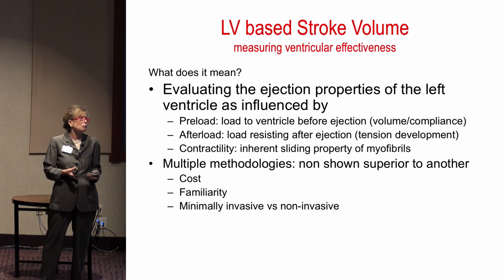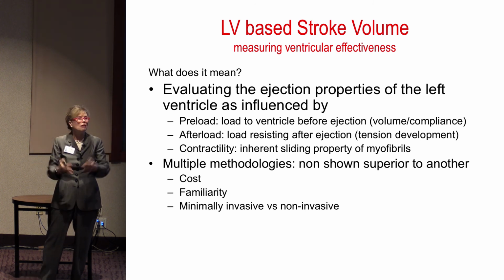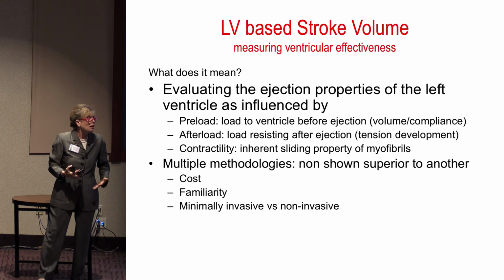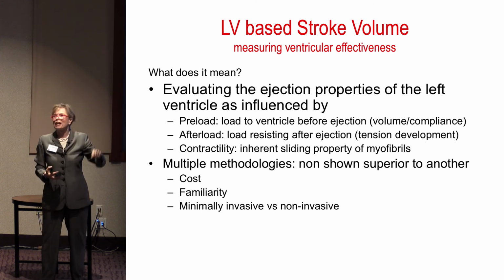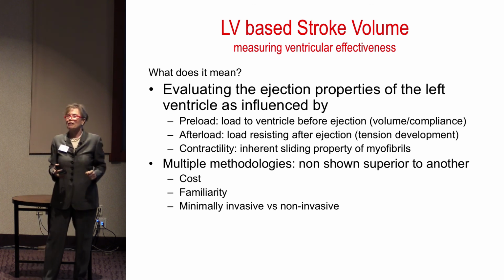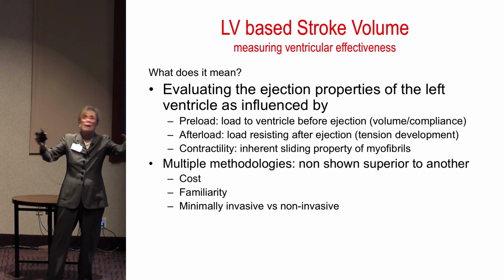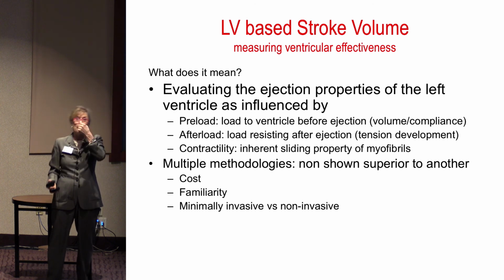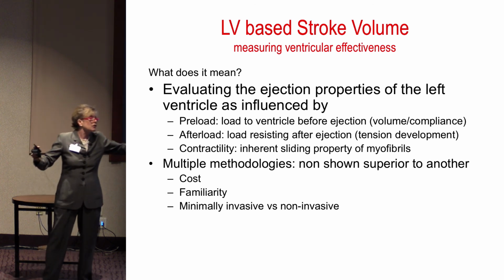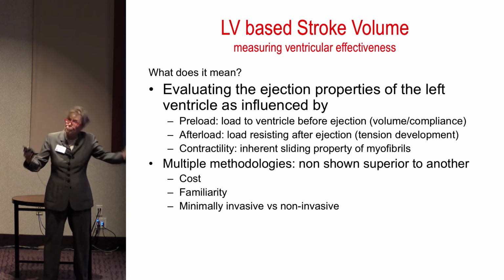So one thing I like to remind everyone, we have a great audience, a lot of variety in terms of profession, but really important for everyone to remember. If you can't get a pulse ox on the right hand and you can't get a pulse ox on the left hand, you don't have good perfusion. In general, you just don't have good perfusion. So you spent 20 minutes, right hand, left hand, all the fingers on the right, all the fingers on the left. Now we move to the ear and the lip and the nose and the head. Still can't get a signal. Meanwhile, your patient is hypoperfused because you've got to have perfusion to have a signal.